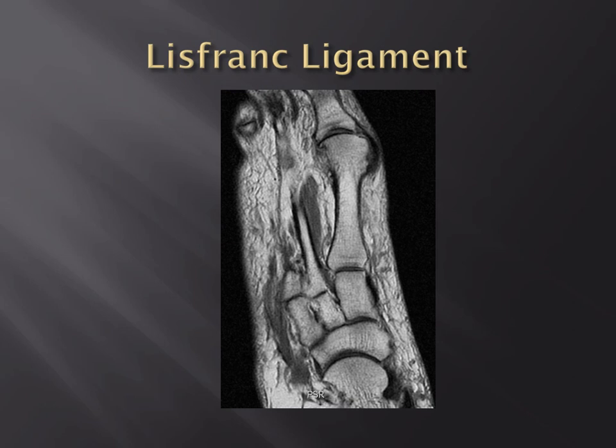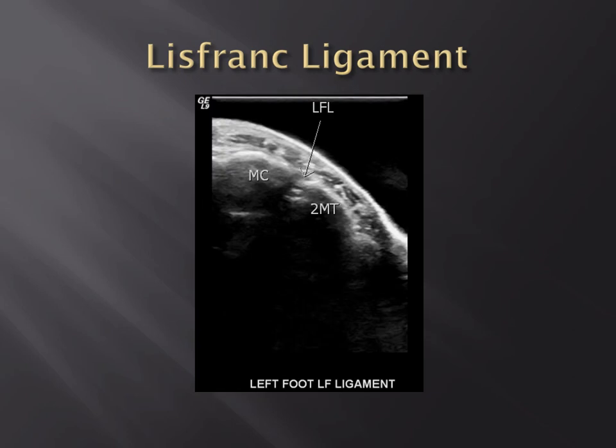Moving to the Lisfranc ligament, we're used to looking for these on MRI, but it is possible to see them on ultrasound as well. This is a good example, again utilizing that water bath technique. You can see that the transducer is not at all adjacent to the skin surface, but this acoustic window is afforded by the water which the foot is sitting in, and you can see the Lisfranc ligament in its expected location.